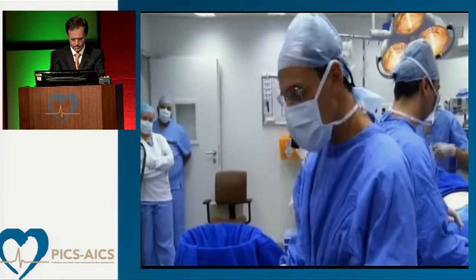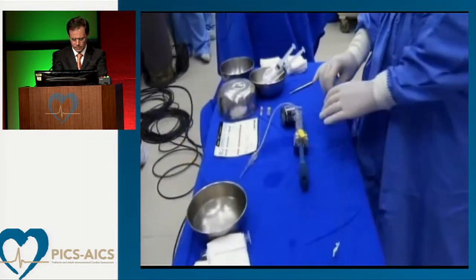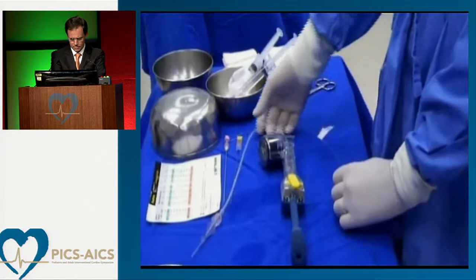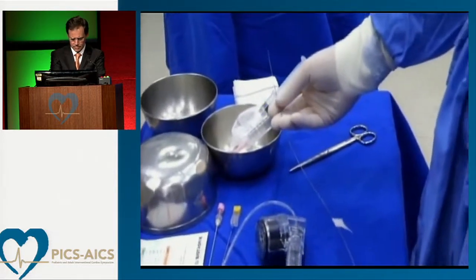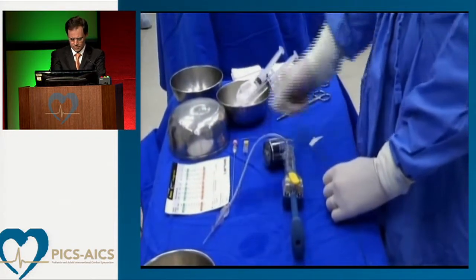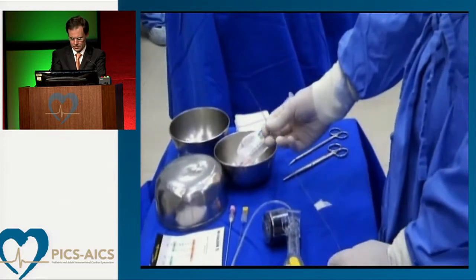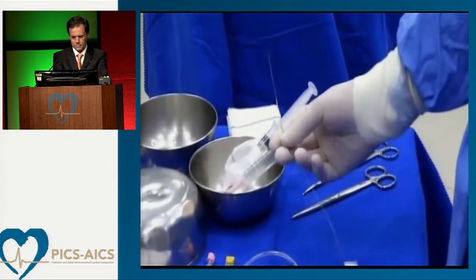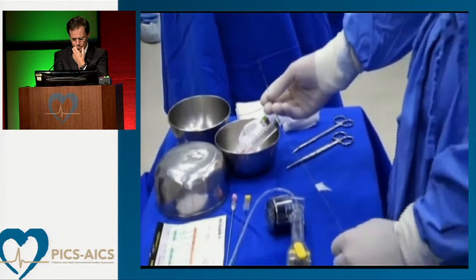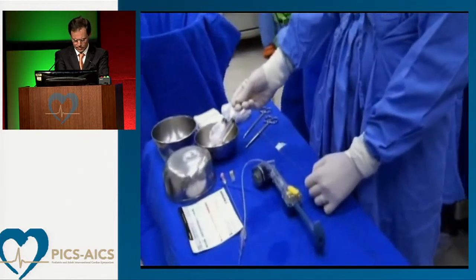Now I'd like to show you the setup we have here on the table. As you know, the aortic valve annulus measured 4 millimeters. So we're going to use a 3.5 millimeter balloon diameter by 1 centimeter long. With pressure, this is a very compliant balloon. With 14 atmospheres, we reach 4.1 millimeters. So it's a little bit larger than the aortic valve annulus, and this is the recommendation to achieve complete dilation of the aortic valve, as we're going to see, hopefully.